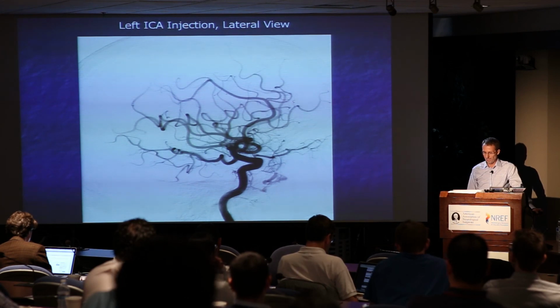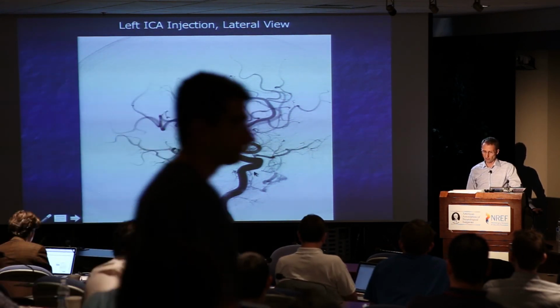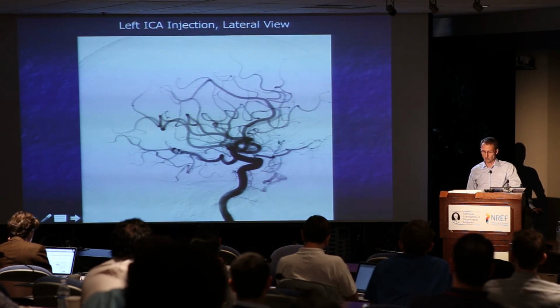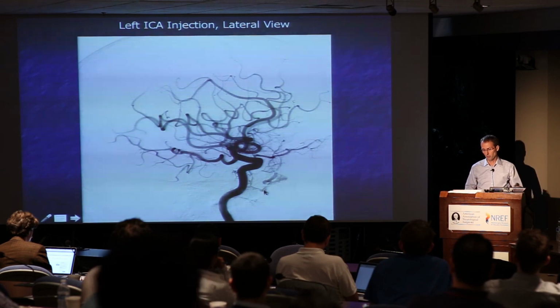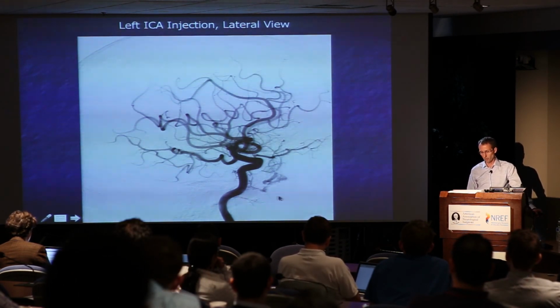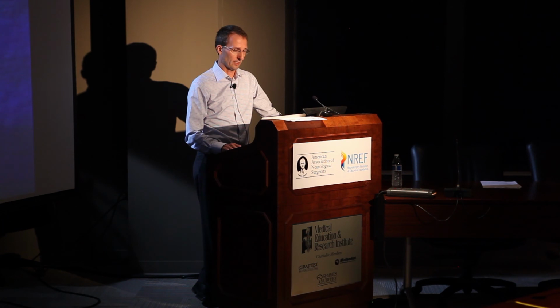One thing you'll notice is that this is probably the inferolateral trunk coming off the cavernous carotid, coming down, and it's also contributing. You actually don't see the high-risk cortical venous drainage because of the competitive inflow to the fistula, but you know that that is where this is going. So we've identified an important branch coming off the cavernous carotid.